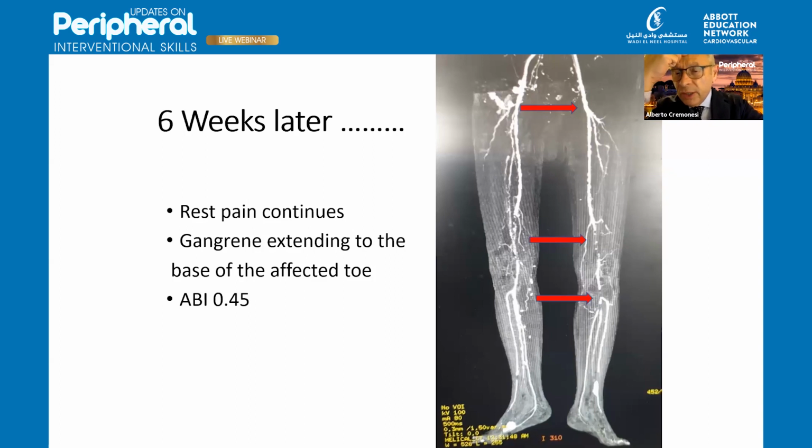So generally, we can discuss about the common femoral, because it was not a very good final result, but I could say acceptable. What in my mind should be treated is the distal SFA and the segment from P1, P2. Probably I missed something in the P3 segment, but in my mind I would have done a stenting procedure in the distal SFA and the P1, P2 segment. Yeah, the procedure actually was aborted at this stage, based on clinical considerations.